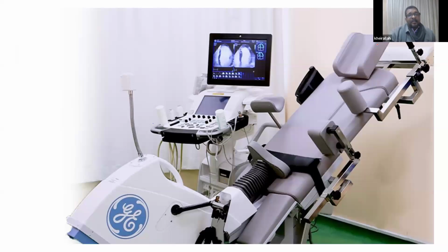And this is the stress echo. Well, stress echo, of course, people have mostly heard of dobutamine stress echo. But dobutamine is pharmacological stress. Sometimes you need physical stress, especially when you are evaluating for valve disease, mitral stenosis, severe, not severe.